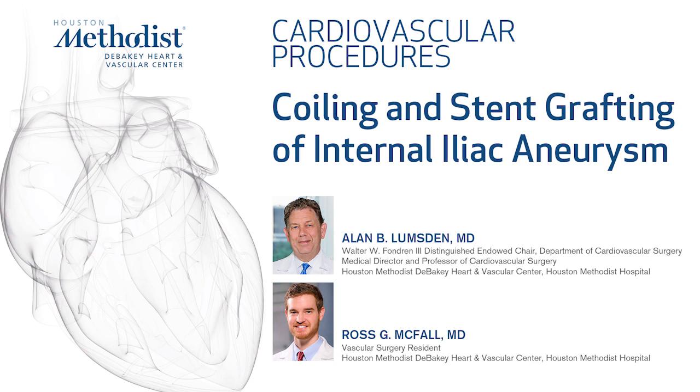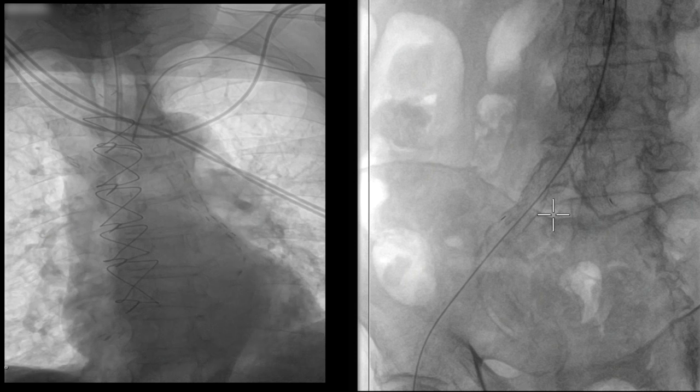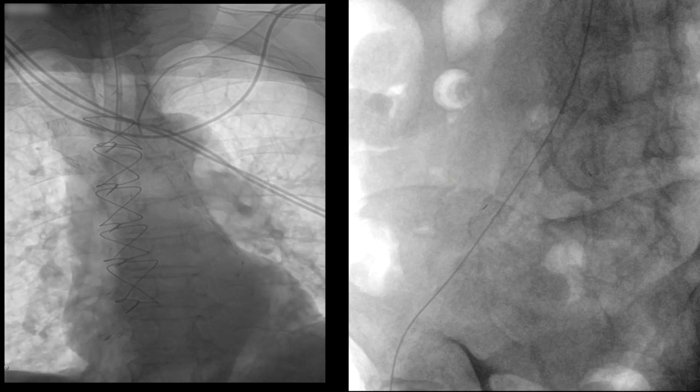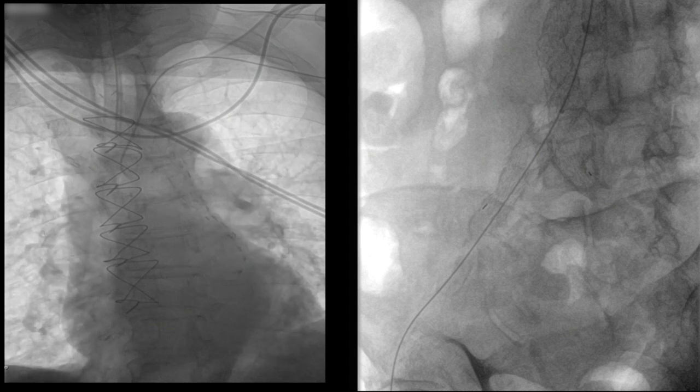This is a case of a patient with a 4cm right internal iliac artery aneurysm, which is treated by embolizing using coils and then sealing the origin with a VBX graft. We approach this in dual format from both the arm and retrograde from the right groin. You can see passing the wire retrograde from the brachial artery down the descending thoracic aorta and accessing the previously placed stent graft into the right external iliac — an Aorfix graft which had been placed previously.